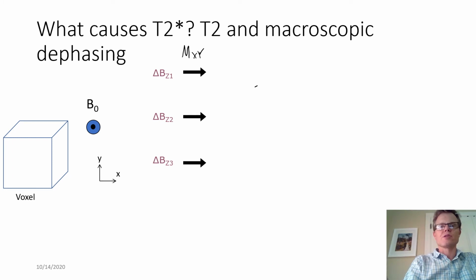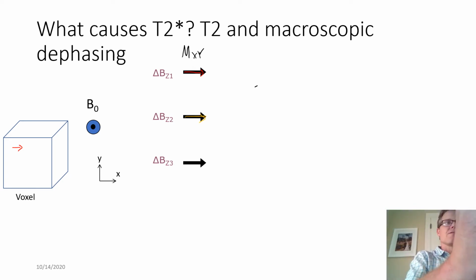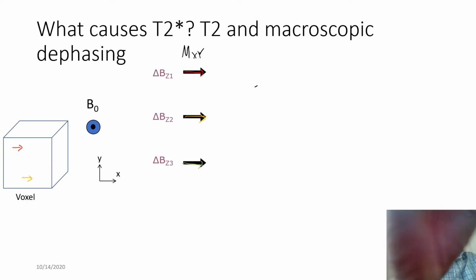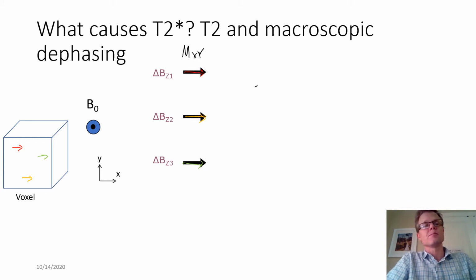And this picture is going to illustrate the fact that across our imaging voxel, so maybe in different locations, we might have slightly different magnetic fields due to main magnetic field inhomogeneities, or largely one of the major factors is magnetic field susceptibility differences.